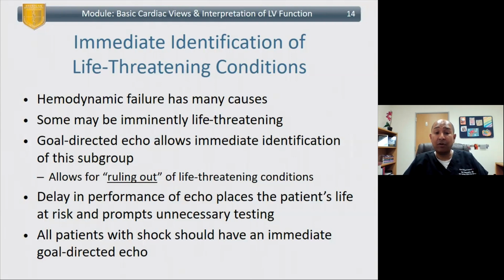And when we talk about all patients with shock, I think that you need to use the echo with other pieces of information, with the history and the physical, and have a plan. And that's why we use that goal-directed echo.